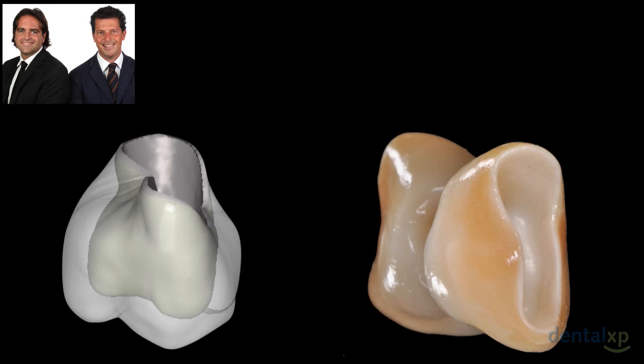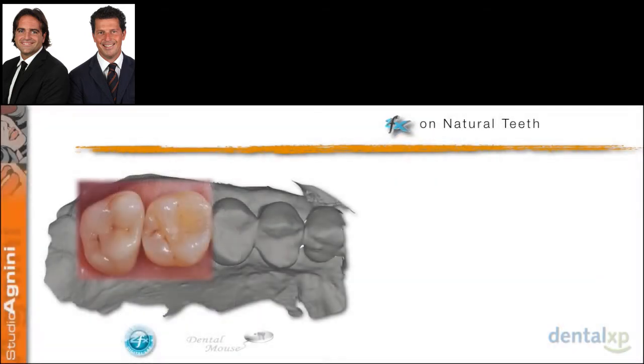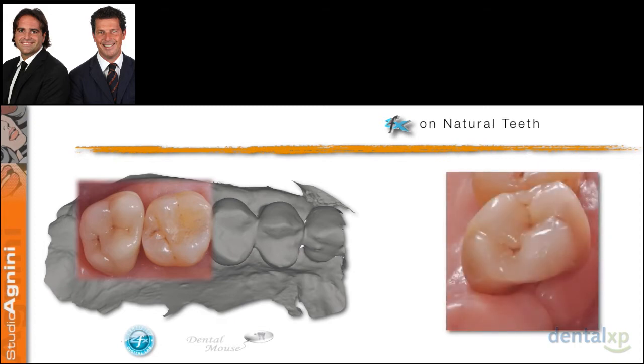Of course you can see the particular shape of this crown, and you can see it here again, one overlapped on top of the other, the digital part and the clinical restoration, from an occlusal view, and also from this clinical view, you can exactly see how we managed to work on the shape of this crown, giving the patient space to clean that area. Don't forget that this was an area that was treated due to a periodontal disease, so maintenance by the patient for longer term stability is really important.